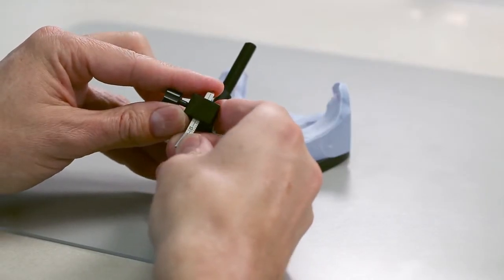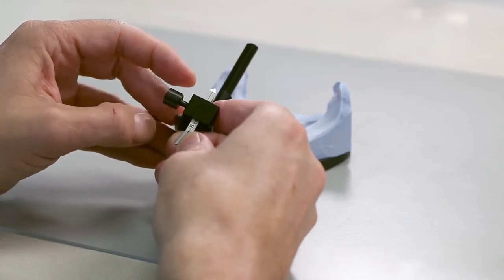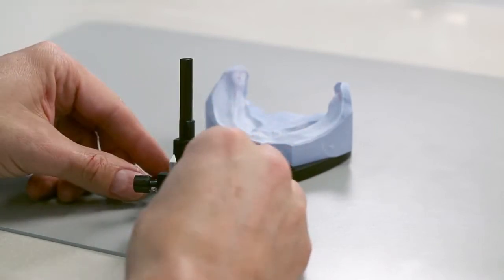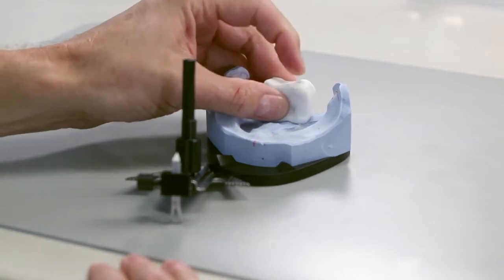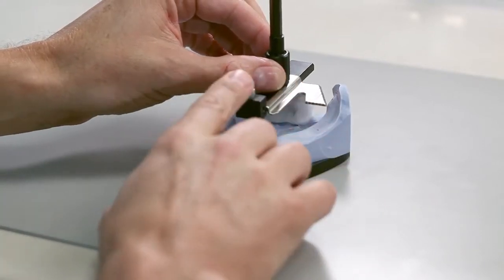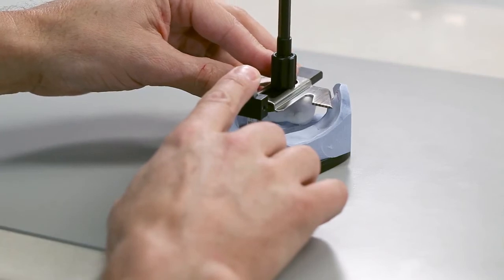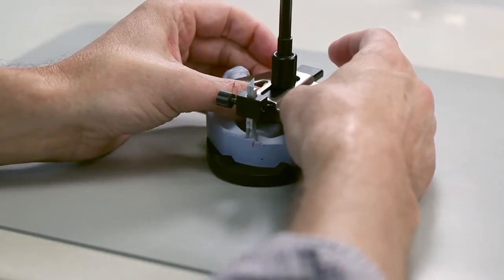Before mounting, set the symphysis fork of the horizontal guide to half the intervestibular distance. This means half the distance between the mucolabial folds of the mandible and the maxilla. The fork sits on the lowest point of the mucolabial fold, oriented according to the midline. Align the side wings towards the dorsal region to half of the retromolar pad. Adjust the wings of the horizontal guide according to the length of the mandible in a sagittal direction.